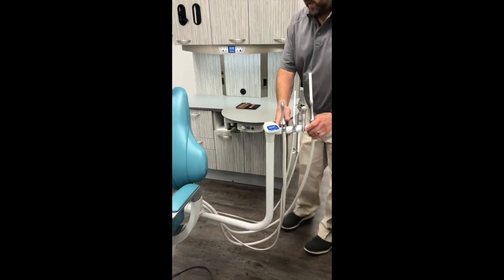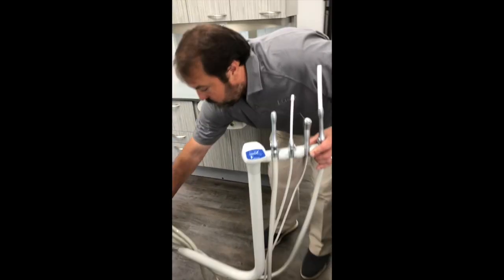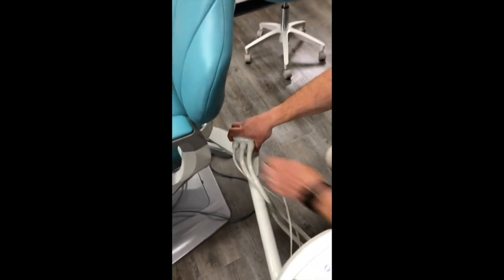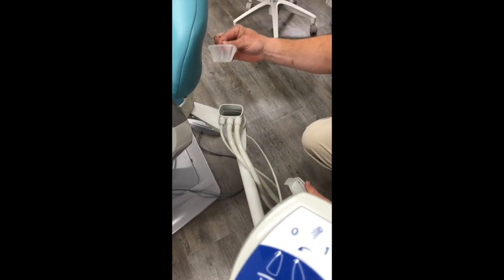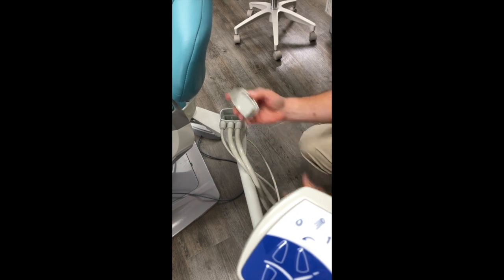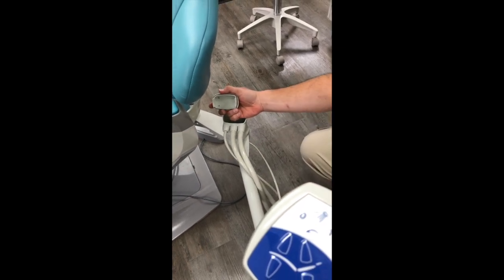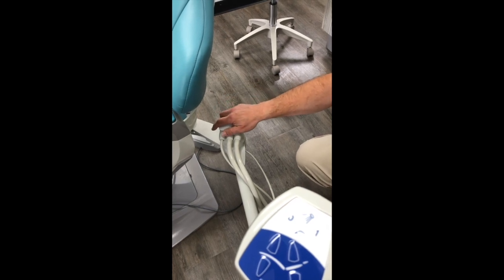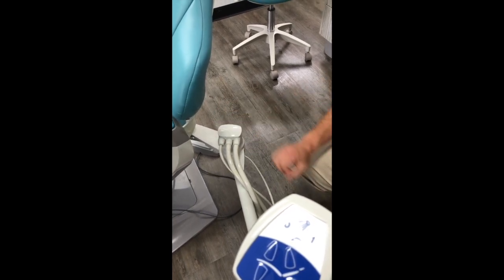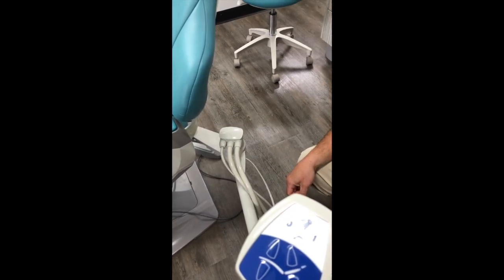The suction trap is down below and it comes off by simply removing the lid — there's a small basket inside. Never try to take this off while the vacuum is running. You will not be able to get it off and you will wind up breaking this piece. Always make sure the vacuum is off before you go in to clean out the vacuum trap.